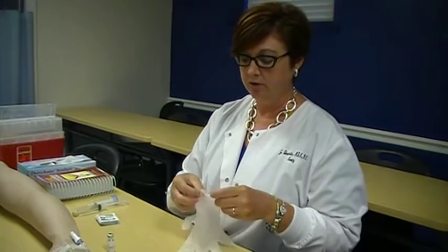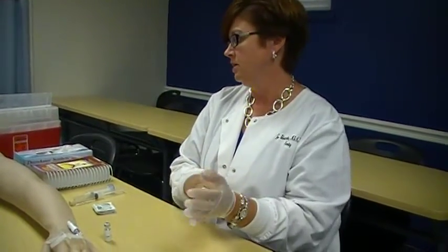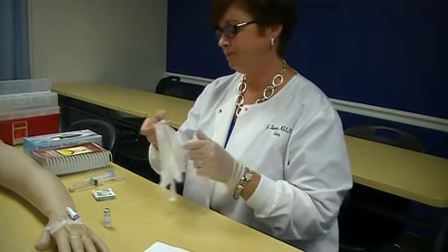The second step, of course, is washing our hands. Again, no matter what skill we always perform, washing our hands is also very crucial. Number 3 says clean the port for 5 seconds with alcohol and apply gloves. You could either put on the gloves before you apply the alcohol, or you can apply the alcohol first. It's up to you. So we're going to get some non-sterile gloves. We're going to place them on.